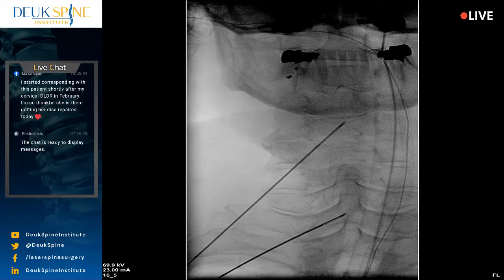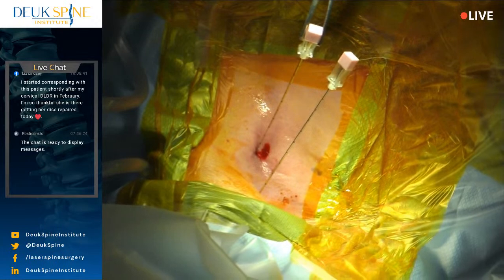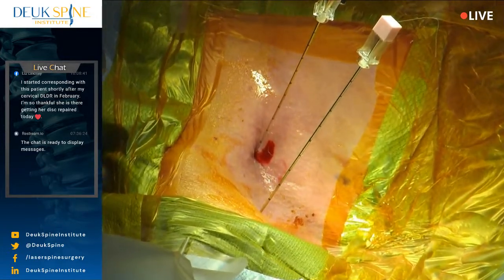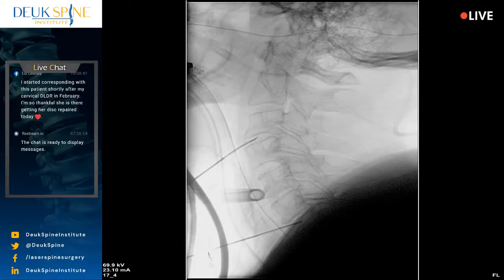Okay, so you're watching live surgery. We don't edit our surgeries. You get to see everything. There's no other surgeon in the world that will show you live surgery of the spine. We've been doing it now for several years. 2, 3, 4, 5, 6, 7. 2, 3, 4, 5, 6, 7. Everyone agree? Agree, sir. All right, relax. We're in the right disc. We're in the right position.